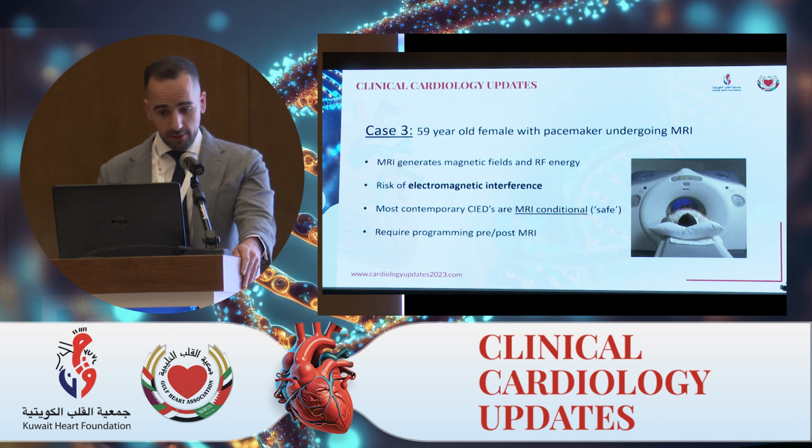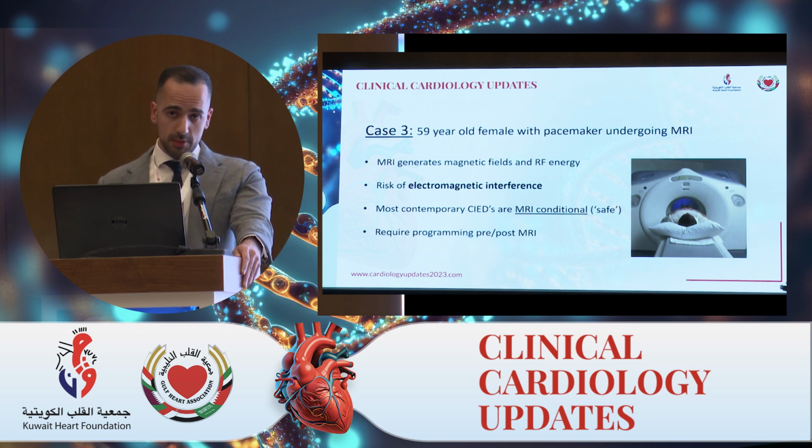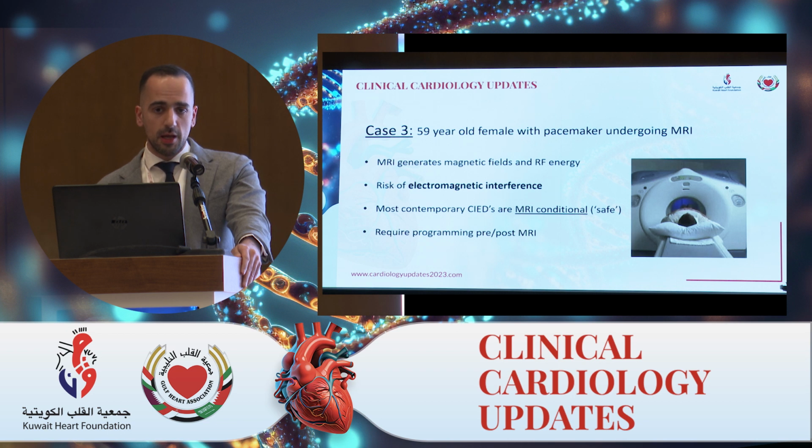And then the last scenario is probably the most common scenario you will face, a patient who has a CIED and needs to undergo an MRI. MRIs generate magnetic fields and RF energy. These electrical signals can be picked up by the pacemaker or defibrillator. And since these devices work based on signals, this may alter their function, and this is what is called electromagnetic interference. Years ago, pacemakers and ICDs were considered a contraindication.